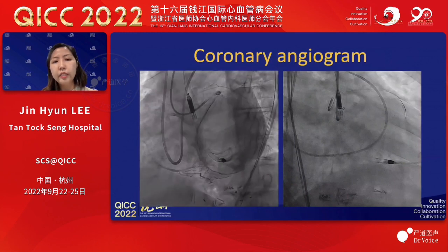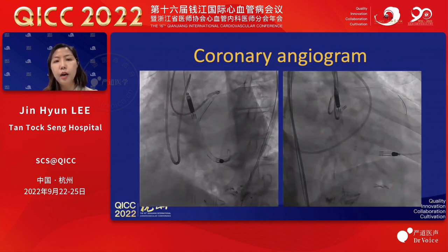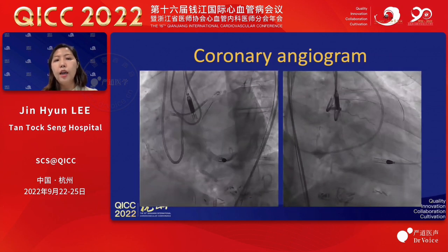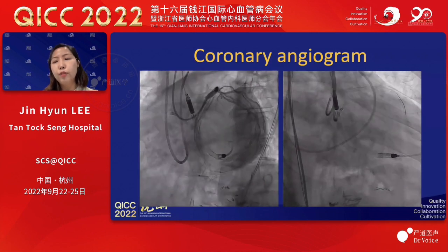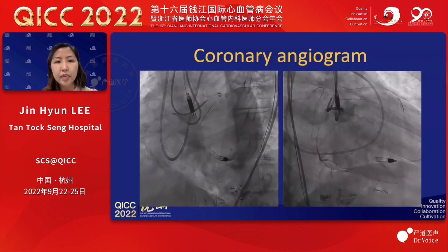We used a single access Impella approach to the right groin, put an Impella CP in, and through that same sheath, we put a 7 French AL 0.75 into the RCA. Via the right radial, we got the retrograde guide, 7 French EBU 3.5, to the left main and put a safety wire down the LAD.